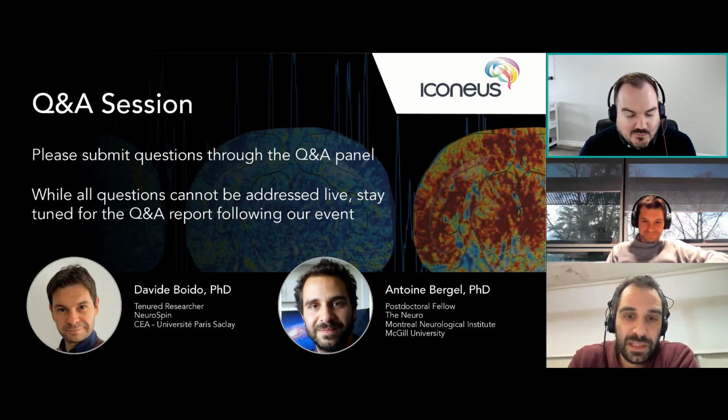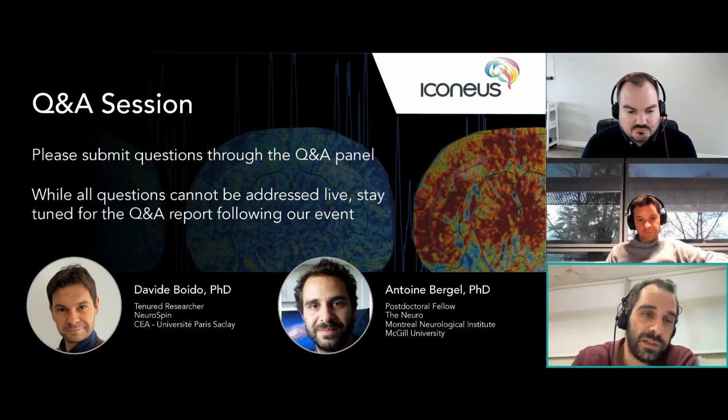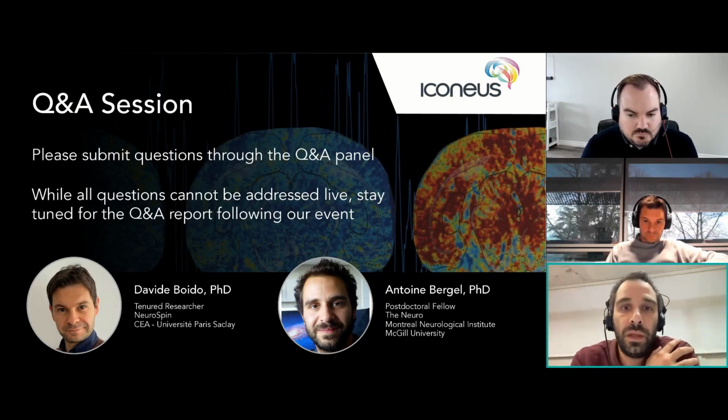Well, anesthesia is a very strong modulator of brain activity, and most of the time it masks many things. For instance, when we do sleep studies, they are two completely different states. So we are actually looking for a technique where we can not use anesthesia, and in the few recordings that I used to compare, we definitely do not have the same correlations, do not have the same baseline, and we see the time that we need to wait to have a signal going back to baseline after the animal woke up from anesthesia.